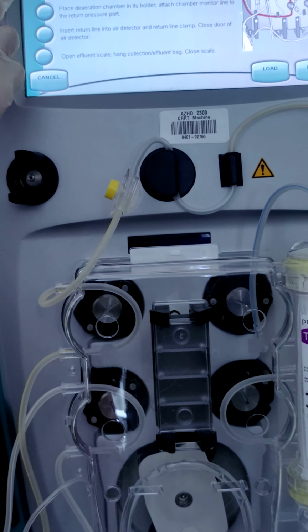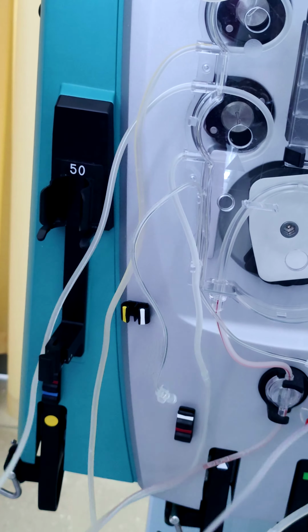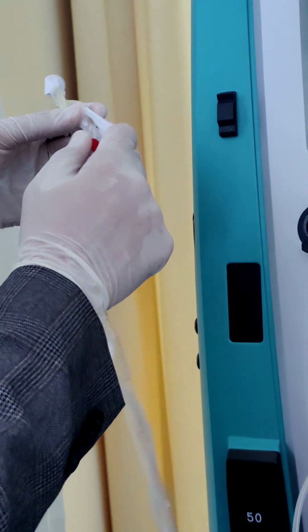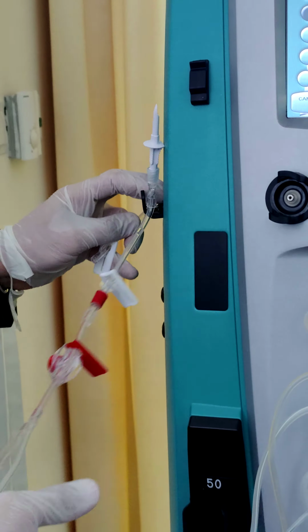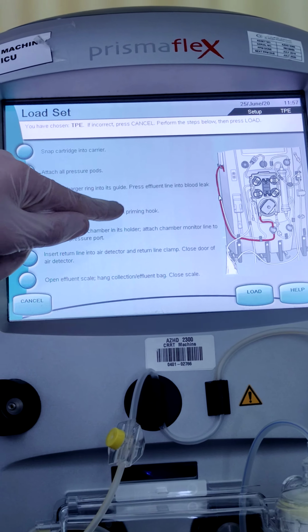Okay. Next, temporarily hang the access line. You see now, the second difference here is about the design of the normal saline. One more, it's coming. Yeah, I think it's coming like this. Just hang it here. Temporarily hang the access line on the priming hook.